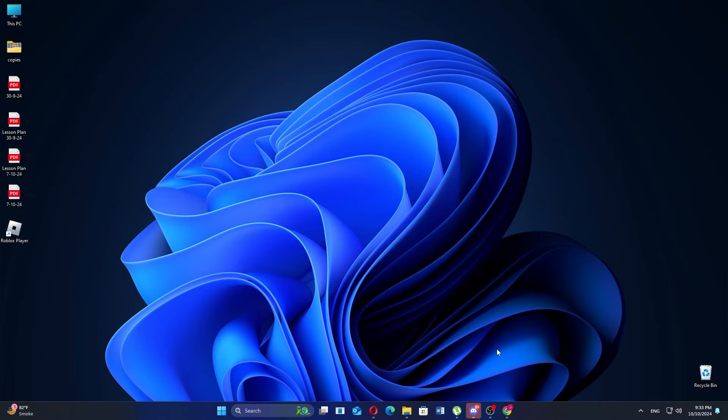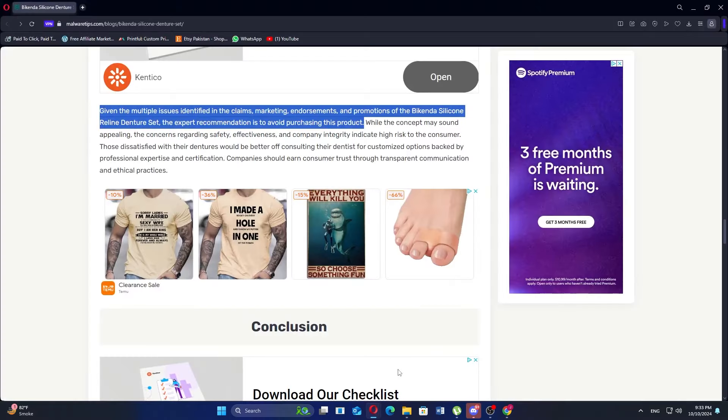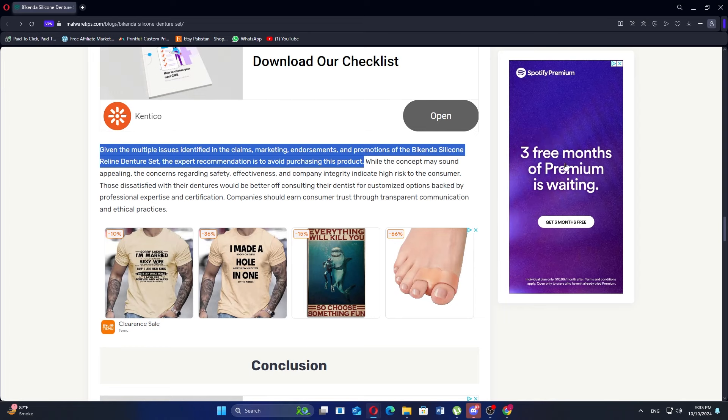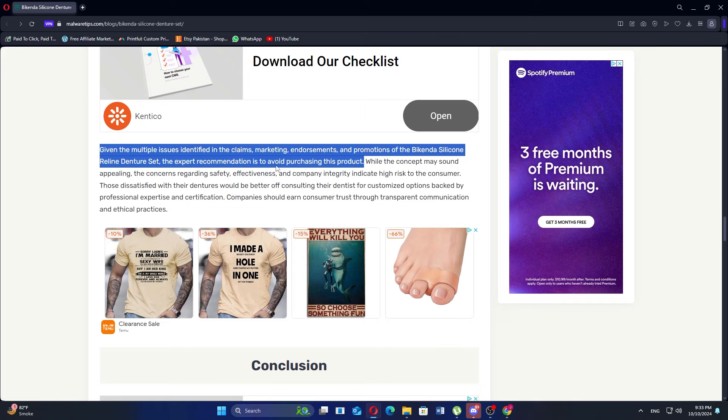The Bikenda Silicone Reline Denture Set is an affordable option designed to improve the fit and comfort of dentures, typically priced around $11. This product aims to provide a custom silicone mold that addresses common issues like discomfort and looseness.